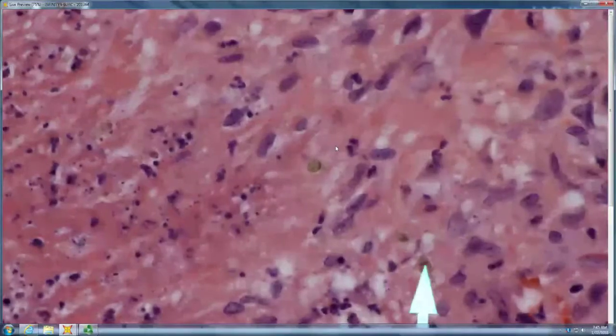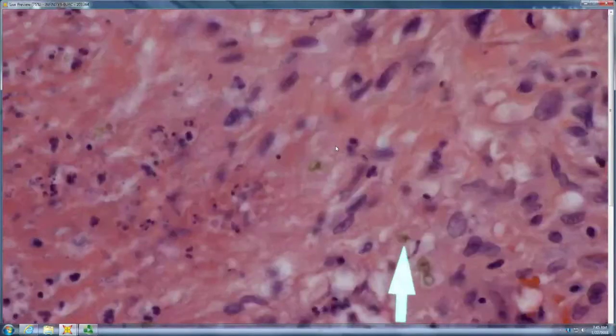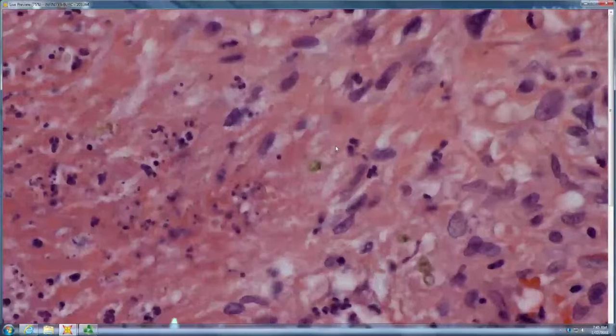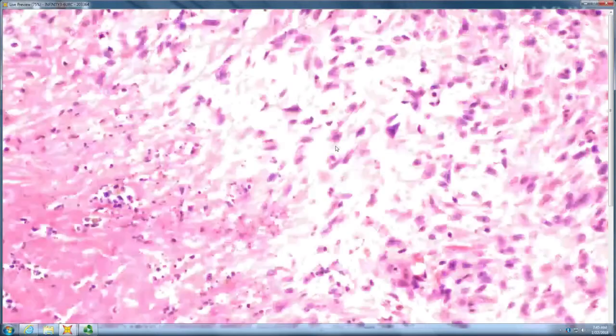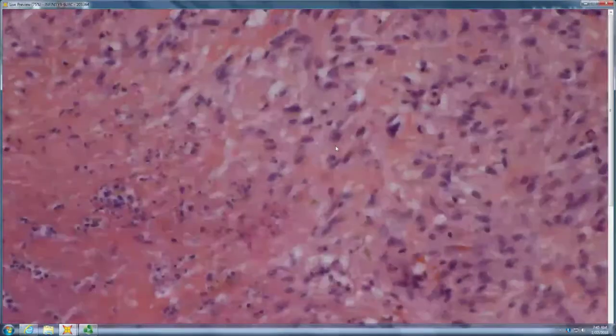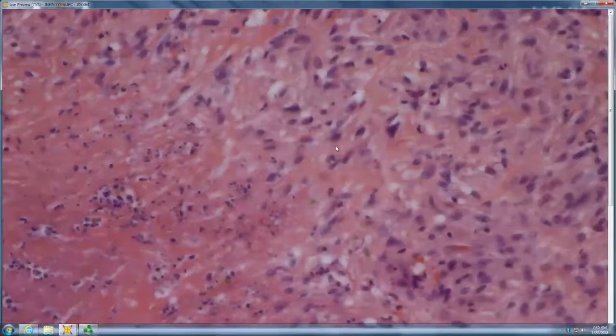So you get fission of the spores in chromomycosis, and then in this case you have some hyphae too. So you are correct. This is phaeohyphomycosis and chromomycosis. Some of the black molds can do both, right? If they're hyphal, it's pheo. If they're spore, then it's chromo.